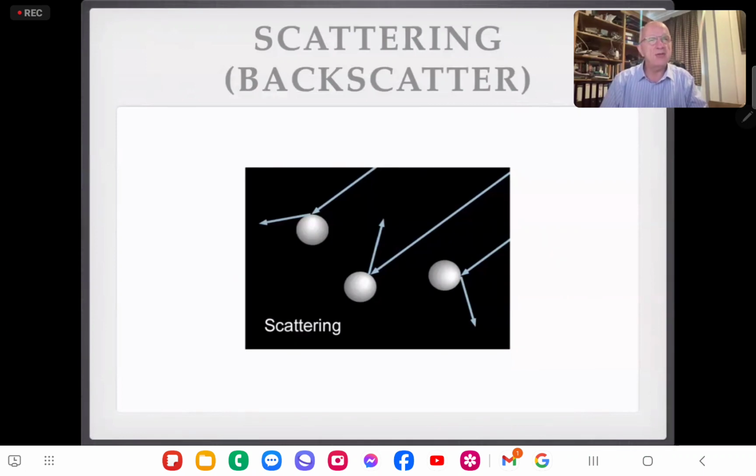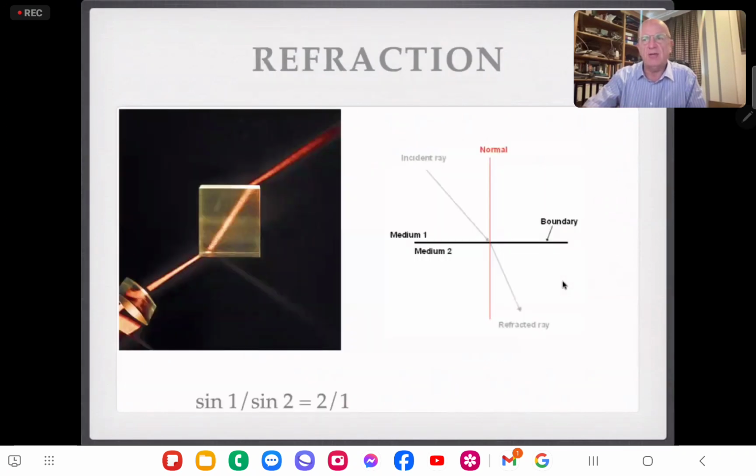So when do ultrasound waves in the body hit something small? That's when they hit red blood cells. So this is the process that happens when ultrasound hits red blood cells. And when ultrasound hits red blood cells, what process were we talking about? We're talking about Doppler. So Doppler, blood pool Doppler signals come from scattering rather than reflection.